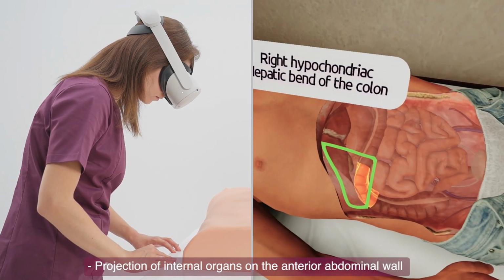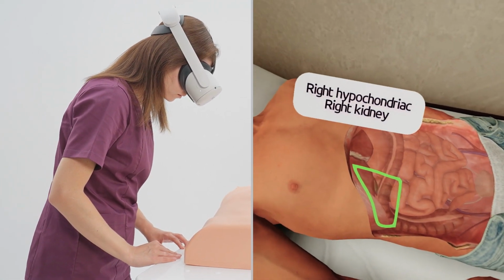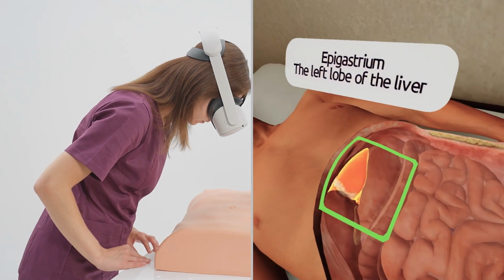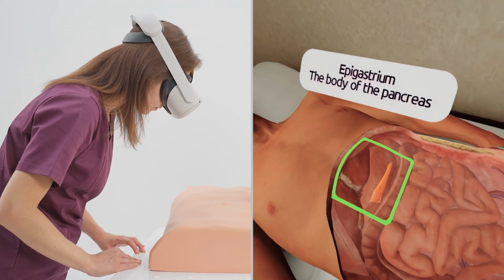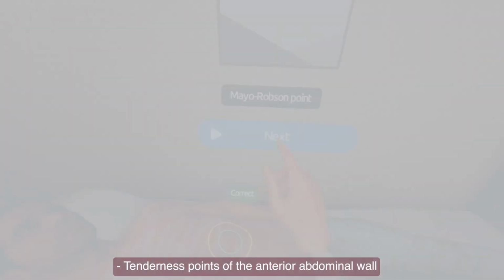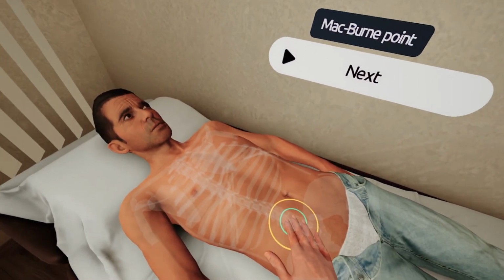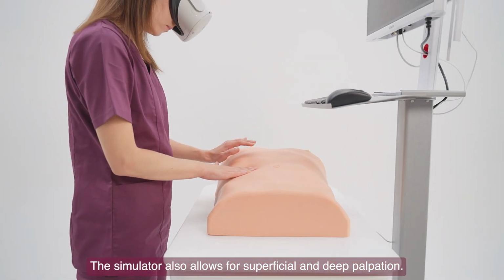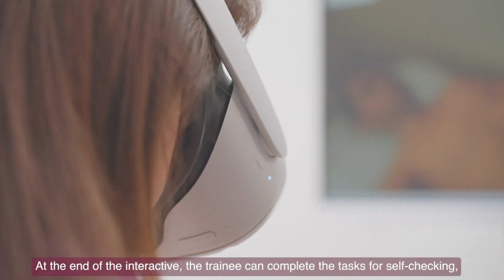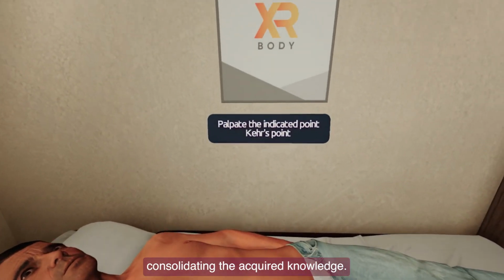projection of internal organs on the anterior abdominal wall, right kidney, the left lobe of the liver, antrum and pyloric section of stomach, the body of the pancreas, tendinous points of the anterior abdominal wall. The simulator also allows for superficial and deep palpation. At the end of the interactive, the trainee can complete the tasks for self-checking, consolidating the acquired knowledge.